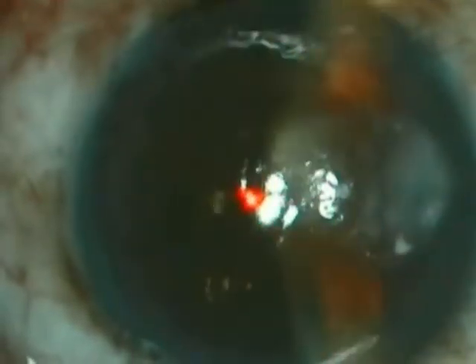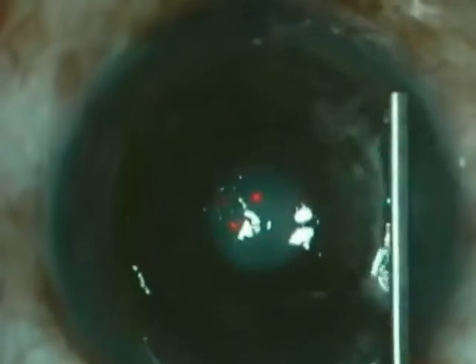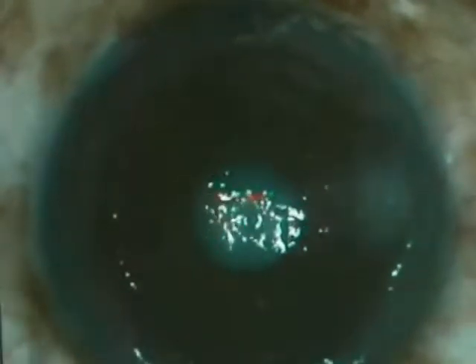This case had bilateral idiopathic band keratopathy with anterior corneal stromal scarring. The calcified layer was debrided from the rest of the corneal stroma using an insulin needle-based superficial keratectomy technique to find the plane of cleavage. After that, we used PTK with BSS as a masking agent to smooth the anterior stromal surface, followed by single application mitomycin C use. The patient improved their best corrected visual acuity from 20/200 to 20/30 in each eye.